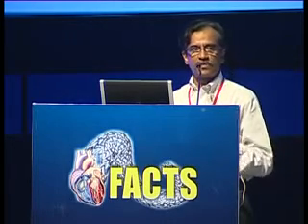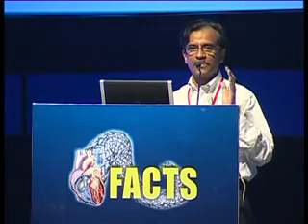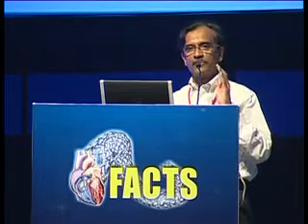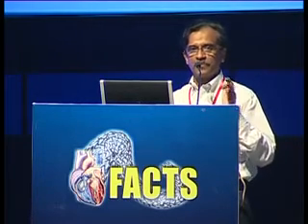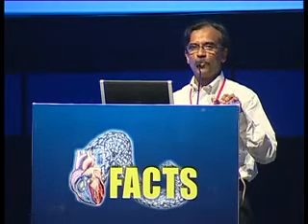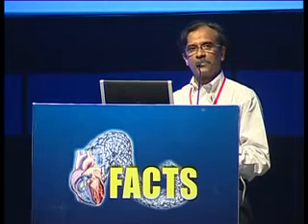So these couple of issues are very important: access the vein as vertically as possible. And when you are advancing the mitral commissurotomy catheter, if you find any resistance, try to enter the femoral vein lumen vertically and then make it parallel to traverse the vein subsequently.